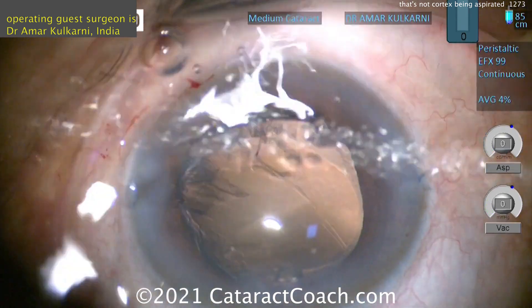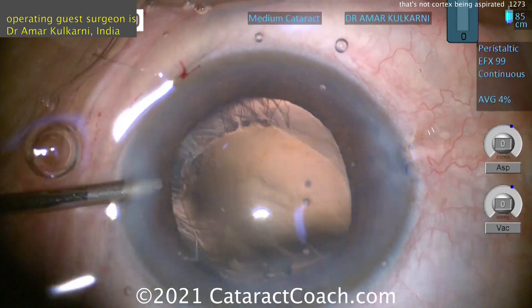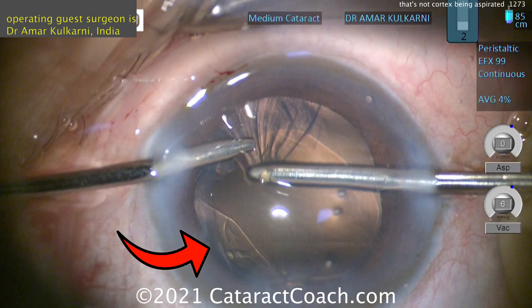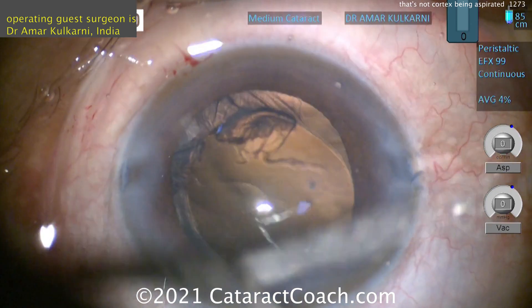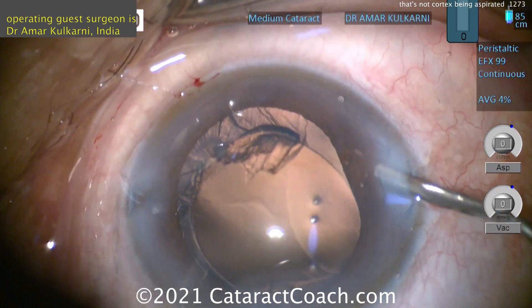There's the loose capsule again. You also don't want to come out of the eye and let the eye collapse. If you come out of the eye and the eye collapses like that, you may get vitreous prolapse. Look at that big zonular dialysis there — yes, you can get vitreous prolapse.